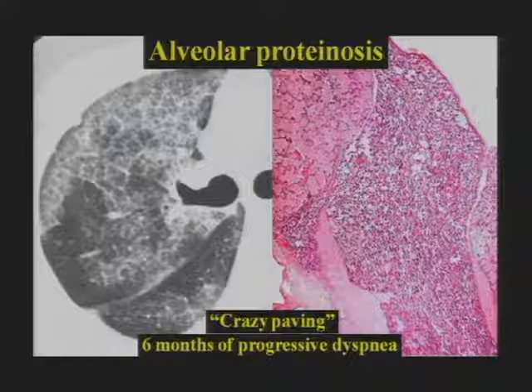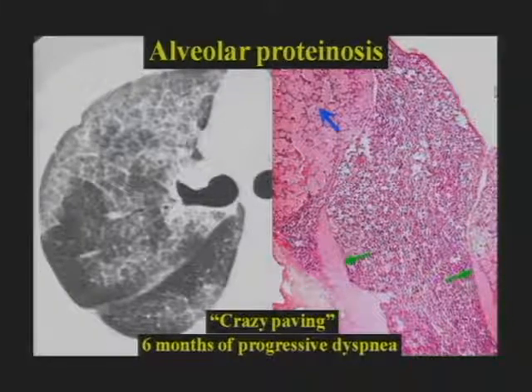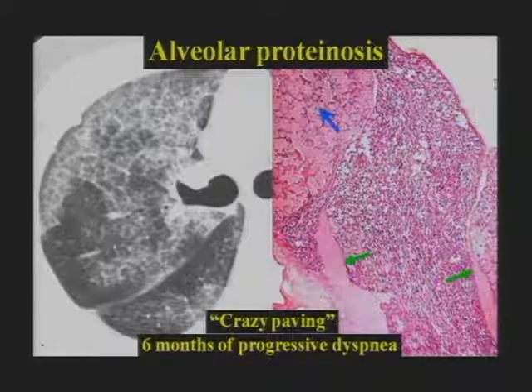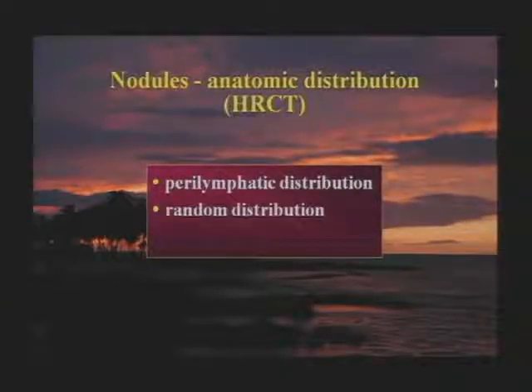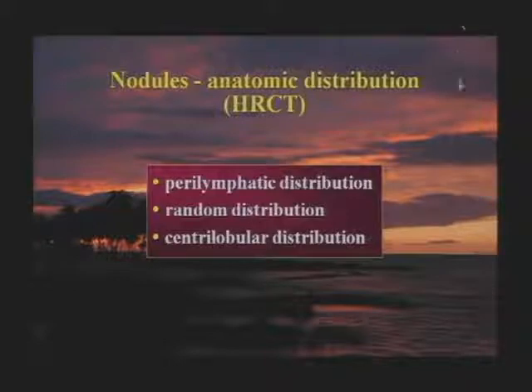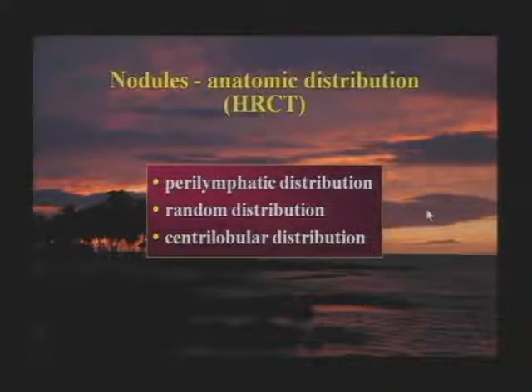The histology of alveolar proteinosis shows filling of alveoli with a proteinaceous material causing the ground glass, with the same material accumulating in interlobular septa causing the crazy paving appearance. Diffuse lung nodules: when nodules are the predominant abnormality on CT, we can characterize them into one of three specific patterns, which helps with differential diagnosis. The three patterns are perilymphatic, random, and centrilobular.